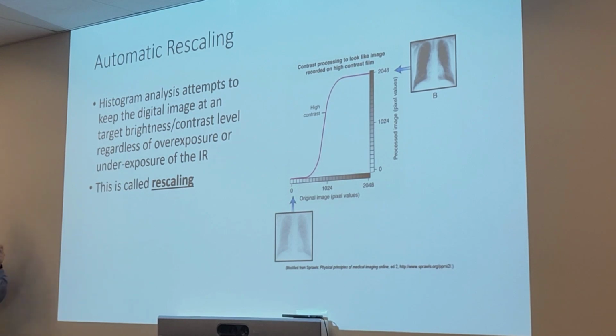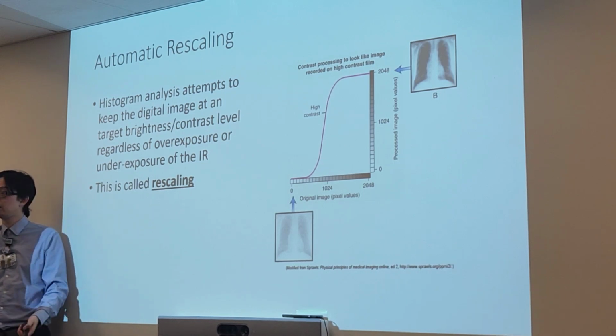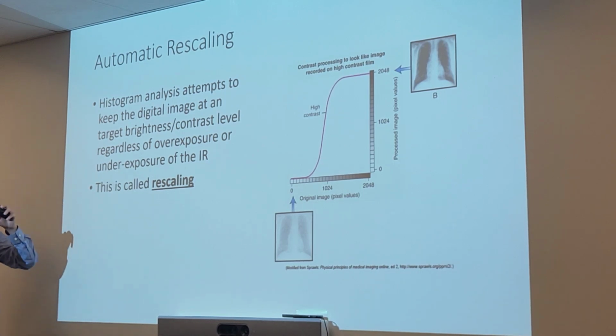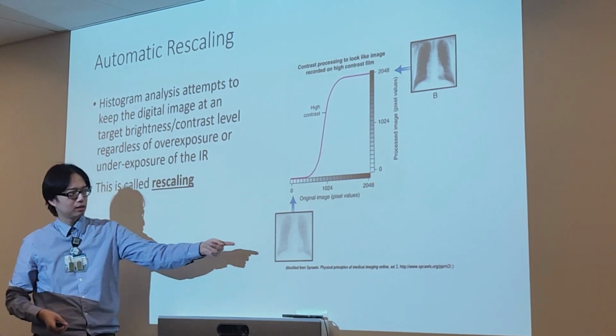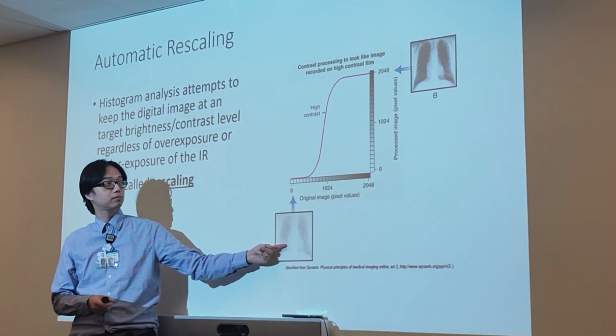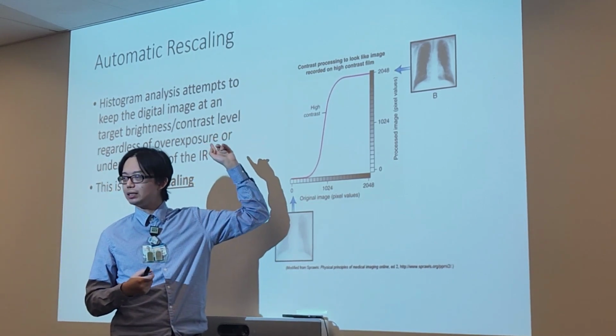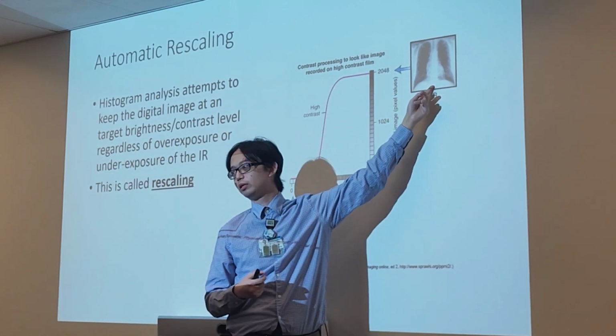Okay. Think about your CR processing. When you're at the clinics and you run the CR cassette, and you know how sometimes the tech checks the image as it pops up on the screen? How does that image look as it comes up on the screen? Super white and gray. It looks kind of white and gray, right? It doesn't look nice like your normal image, right? Only after the whole thing pops up does it take a second and then suddenly, bam, it looks nice, right? So that initial image is actually what is being collected. That's your raw data. Afterwards, you take that raw data and it rescales into the proper image.